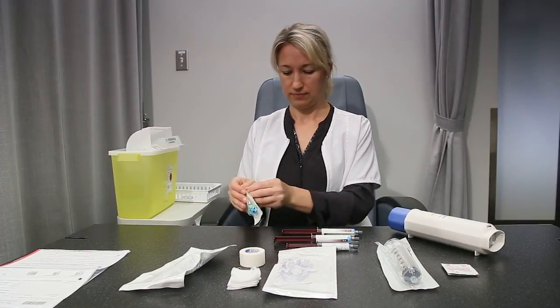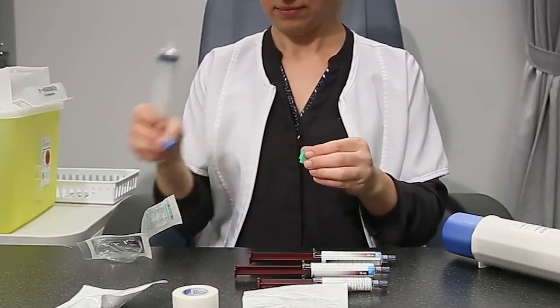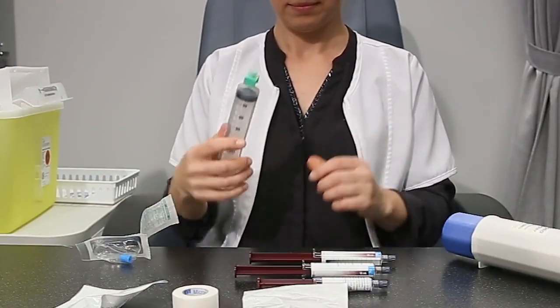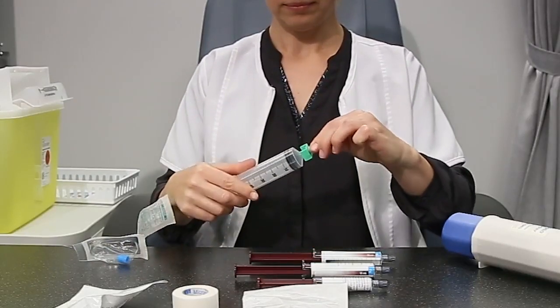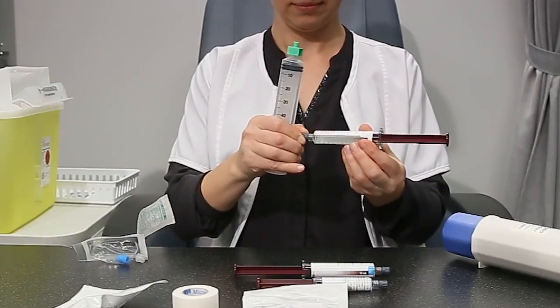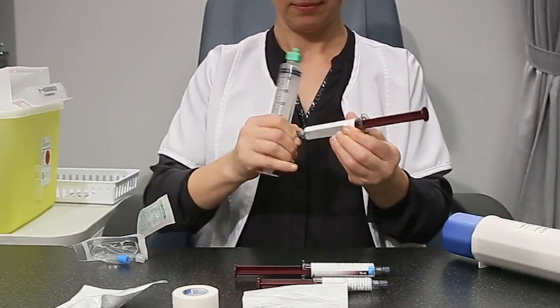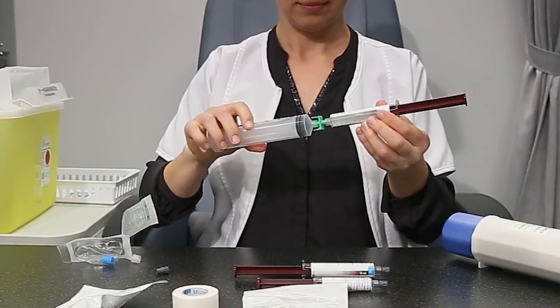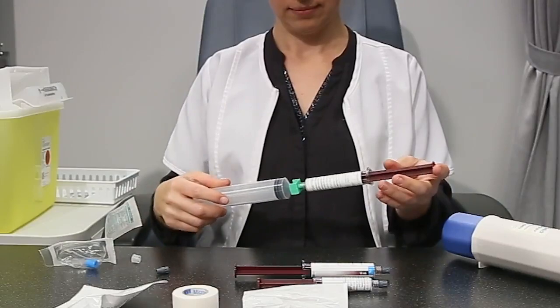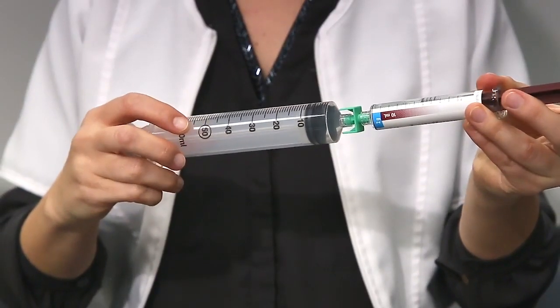Open the connection device package. Remove the blue screw cap on the connection device and connect with the 60 cc syringe using a clockwise screwing movement. Make sure to do so in a sterile manner. Open the 60 cc syringe package — the syringe tip is not protected, so make sure that it remains sterile until ready to use. Note that the connection device tips are bi-directional; you can use either tip to connect to the syringes interchangeably.